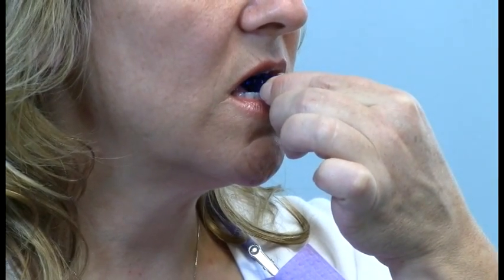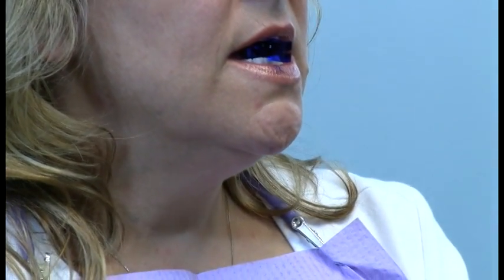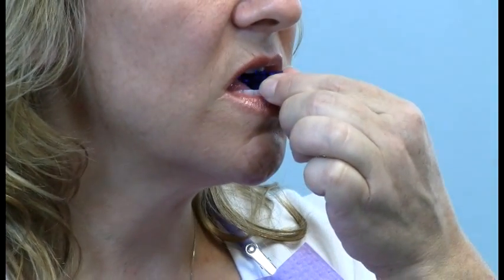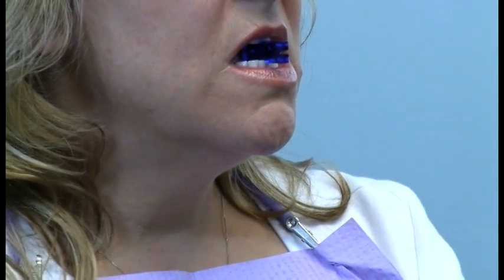So now let's go to the 8 millimeter vertical. Teresa, that first notch on the top will put you at a 2+ on the AP or the horizontal mode. I would have to say that that's probably over a 5. Over a 5, okay. Now we're 3 millimeters anterior. That's probably about a 5, but a little less than that. A little less. You like that first one, the 2 millimeters.